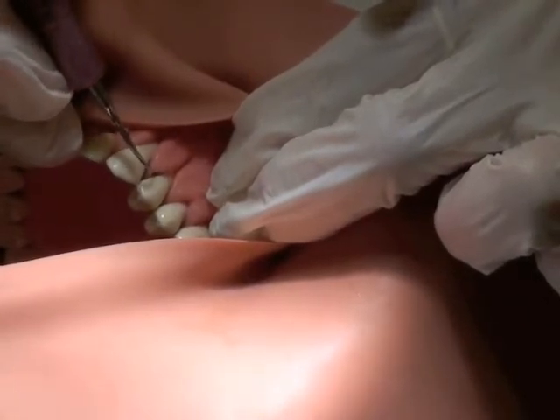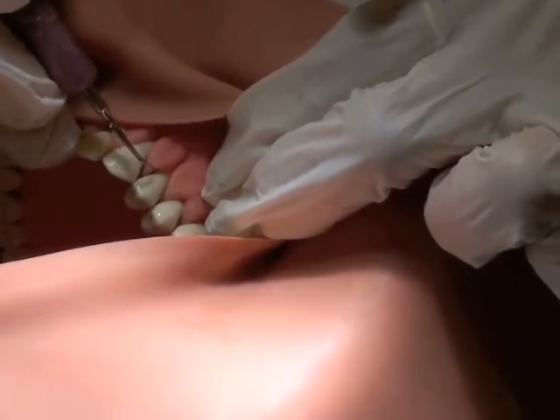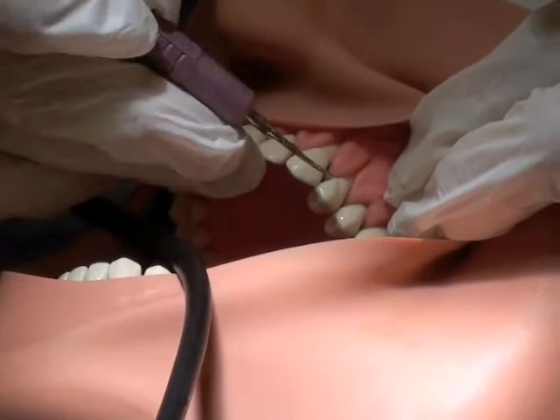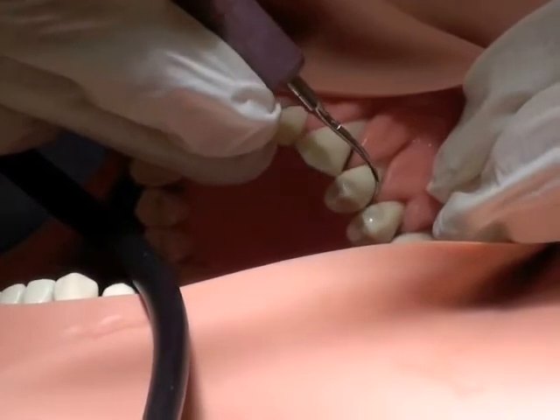Insert that coloring motion, pulverizing the deposit, killing the bacteria, going in an apical direction. Go to a horizontal stroke, interproximally, come out on the facial, and a horizontal stroke back into the interproximal area.